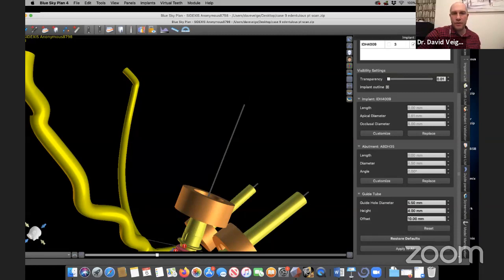What materials do you use to pick up your temporary cylinders to the PMMA provisional? And do you remove the entire prosthesis to neaten up the polish, the internal surfaces? Yeah. Okay, so when I first started doing this, my height between the temporary prosthesis and the soft tissue wasn't very good. So I had to do a lot more manipulation. Now I do take it off to fill in all the little spaces, but I actually do everything chairside now. I used to use a technician within my lab to do it, but now I don't need to do that because I've dialed things in a little bit to allow me to make this really, really easy.